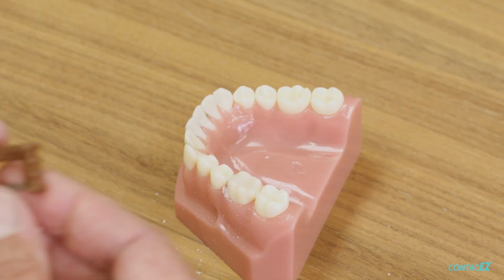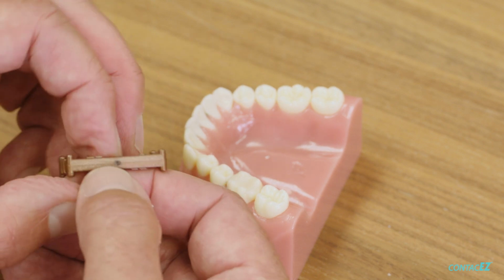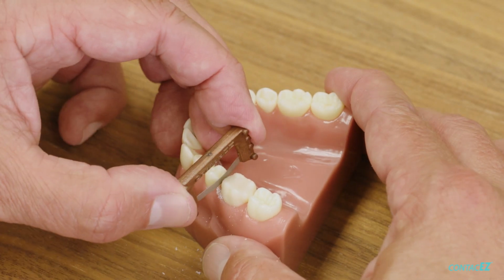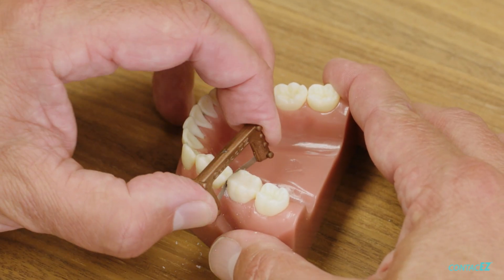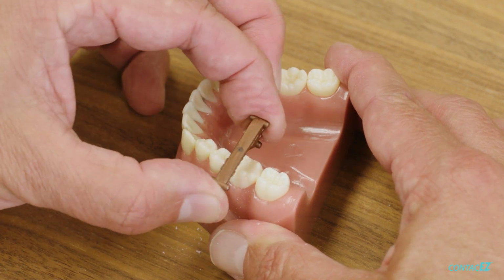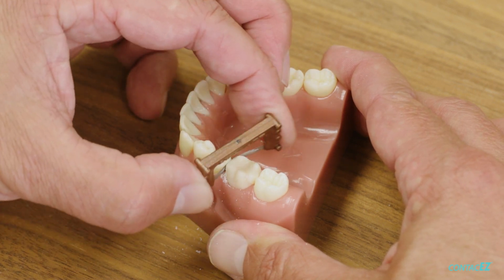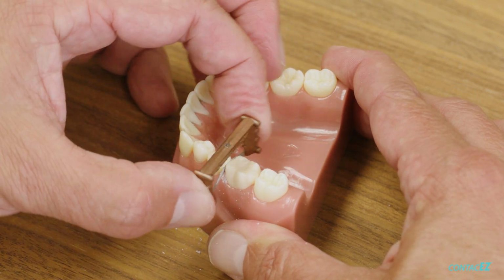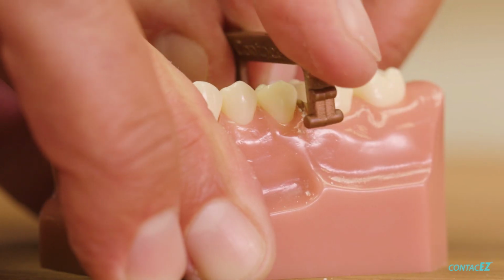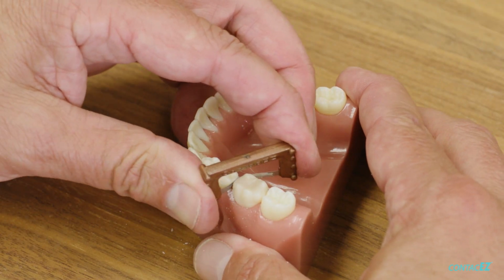And then lastly, we're going to take our copper narrow strip, and this is the one that's got the fine diamond on the single side, so you make sure that you're not using the shiny side. You always want to have the side with the abrasive towards the material that you're using, and go in and start initially with your buccal lingual movements, and then you can tilt the head of it back towards the distal or move the handles back towards the distal and roll it just a little bit depending on how wide your proximal box is. If you have a narrow proximal box, you can just go straight back and forth. If the cavity prep was a little bit wider, you can take this and kind of go around the corner with it as well.